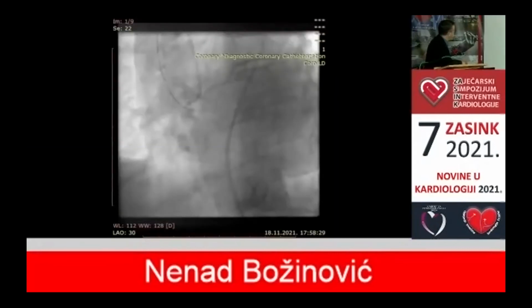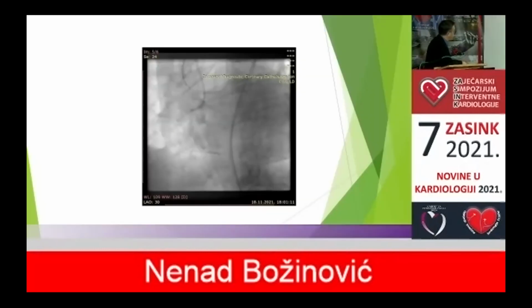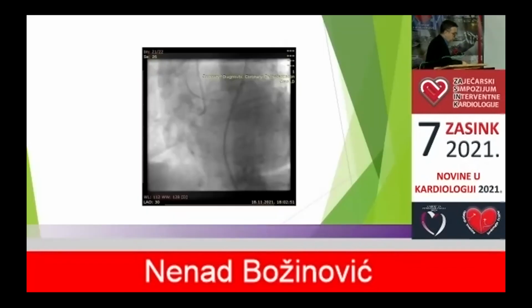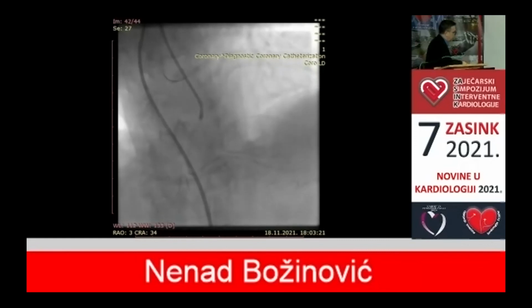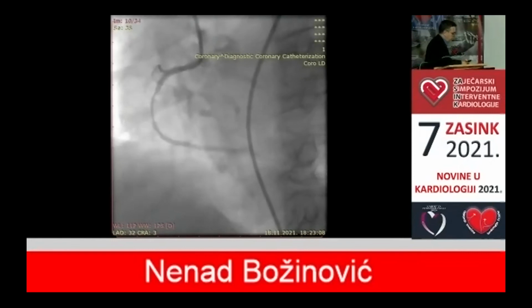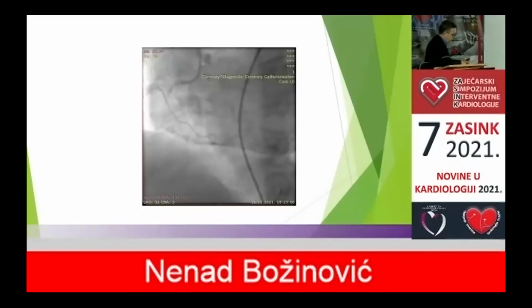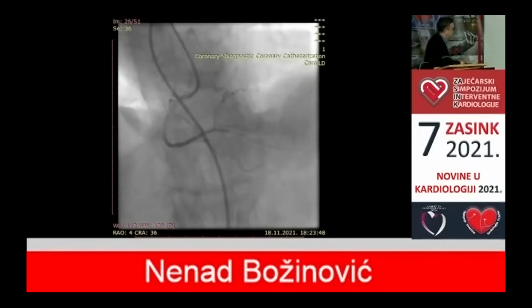After predilatation, I put some stents, a small and then a bigger balloon. And then I put a small amount of contrast just to see where the CTO segment is. Then I put some stents just to the distal part of the CTO. And there is my final result. And we will check that in the next 6 months. This is epicardial, and thank you very much.